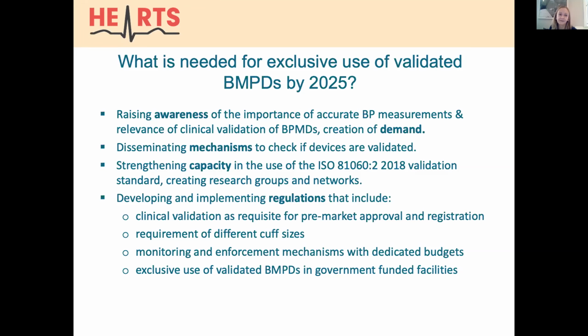We have to disseminate the mechanisms to check if the devices are validated. These are the resources online that were mentioned that list the blood pressure devices that have already been validated for accuracy.